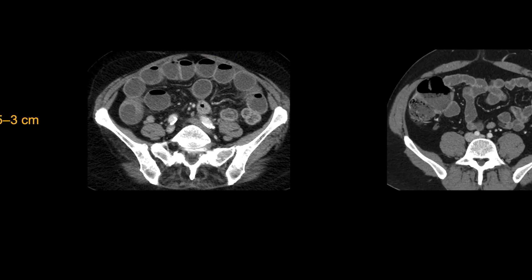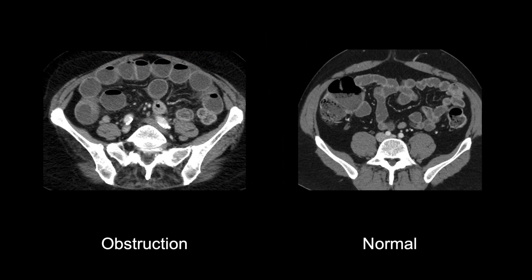It is helpful to remember that normal small bowel may have some fluid or even a slightly dilated loop or two, but normal small bowel does not have that tense, crowded appearance of many dilated loops as seen with an obstruction.